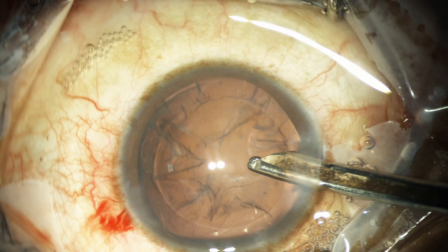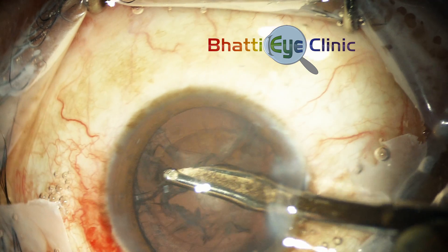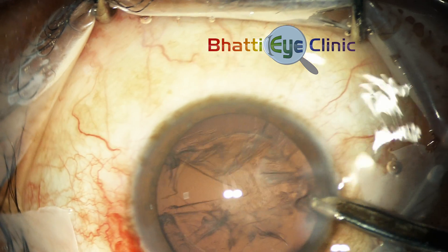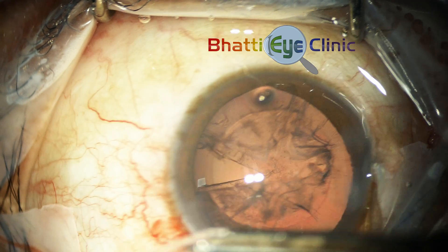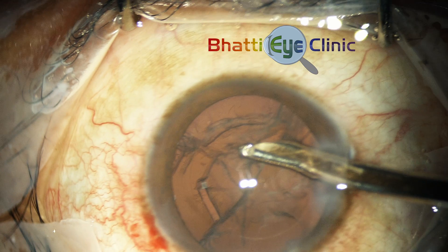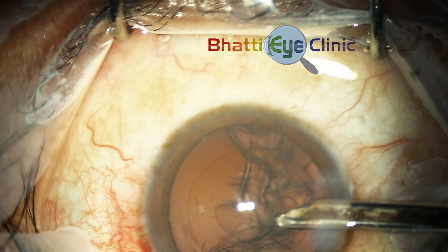In this video we will see how irrigation aspiration is done in a relatively atraumatic and precise manner. The trick is to first maneuver the irrigation aspiration cannula under the anterior leaf of cortex and then using low suction to strip it out and bring it to the center. Once it's in the center, either it can be aspirated by increasing the suction or it can be stripped entirely out of the wound.